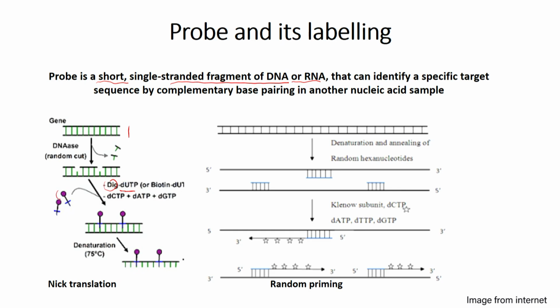So, this is fluorescently labeled and this will get incorporated if DNA synthesis is there. When DNA synthesis is occurring, this goes into the double stranded DNA. So, this DNA has now got labeled. If you denature it, this becomes single stranded and that is ready as a probe.